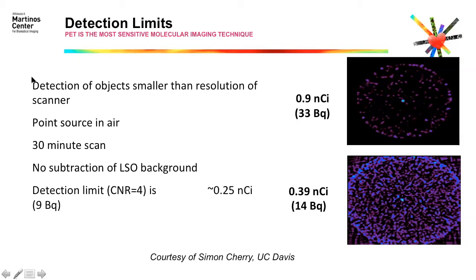And this is important because you will probably have noticed, and I should have said before, PET images are blurry, and that's because the resolution of the PET scanners is much poorer than the MRI or the CTs. In an MRI we can go even now below 1 millimeter voxel resolution. For PET images, the resolution is around 3-4 millimeters, 5 sometimes. With very good dedicated PET scanners, you can go a little bit lower than 3, but it's still not as good as an MRI image.